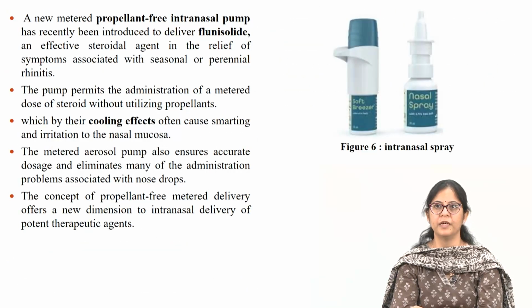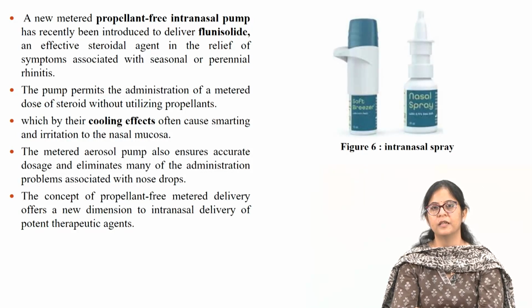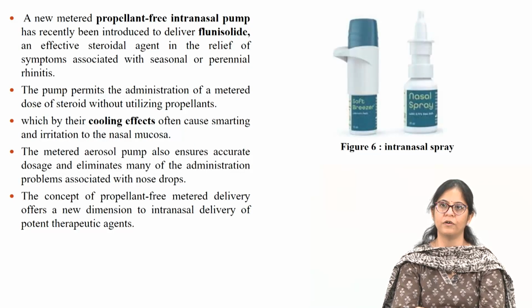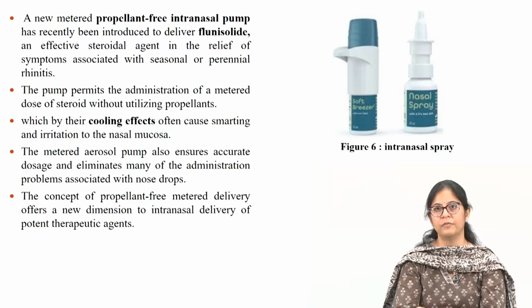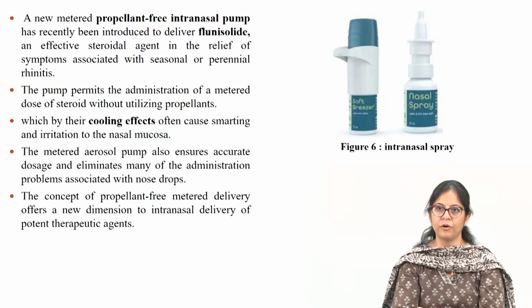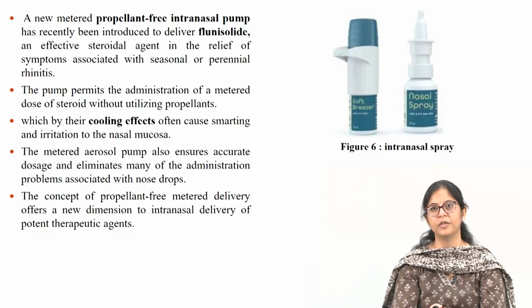A metered propellant-free intranasal pump has been introduced to deliver flunisolide, an effective steroidal agent in the relief of symptoms associated with seasonal or perennial rhinitis. The pump permits the administration of a metered dose of steroid without using propellants, which by their cooling effects often cause smarting and irritation to the nasal mucosa. The metered aerosol pump also ensures accurate dosage and eliminates many of the administration problems associated with nose drops. The concept of propellant-free metered delivery offers a new dimension to intranasal delivery of potent therapeutic agents.